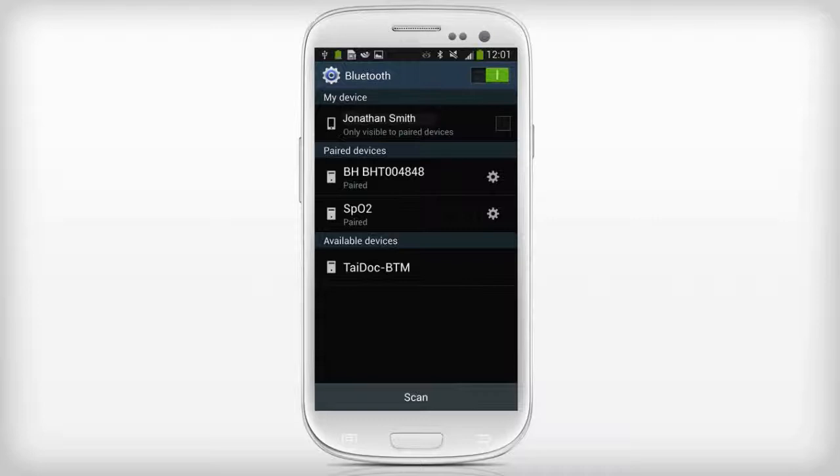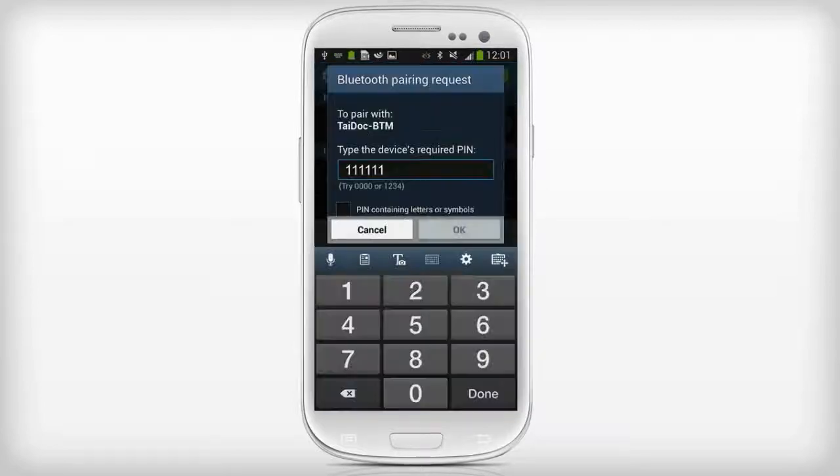On your phone, press the Scan button and wait till you see the TAIDOC-BTM device showing in available devices. A pop-up will ask to pair with the Fora monitor. Enter the PIN 111111.